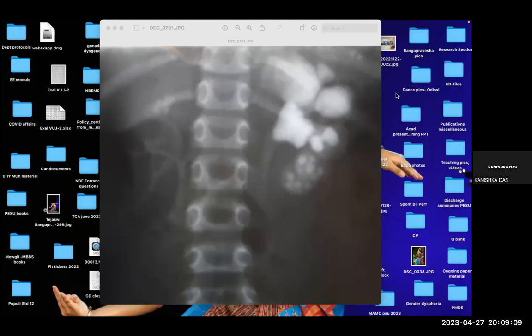Fine. So let's start with this. The plain radiograph. Sir, this is a plain radiograph of the abdomen with a contrast study, delineating the left kidney. It's an IVP study. The left kidney shows multiple blobs of contrast within the kidney, with no draining distally.